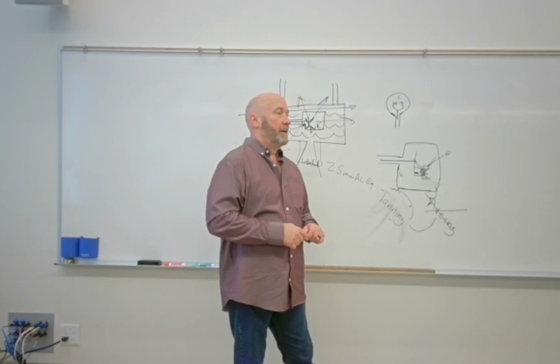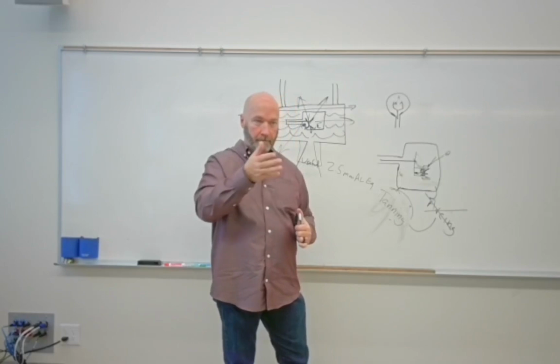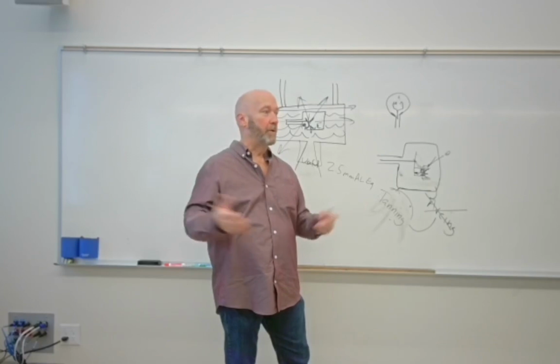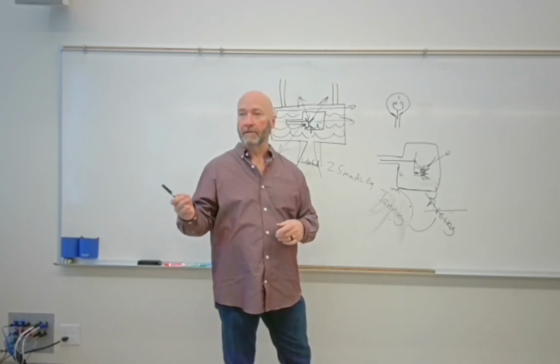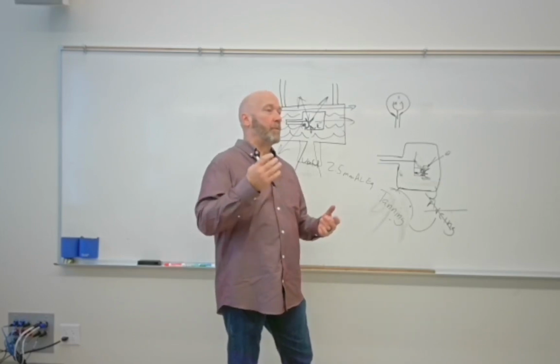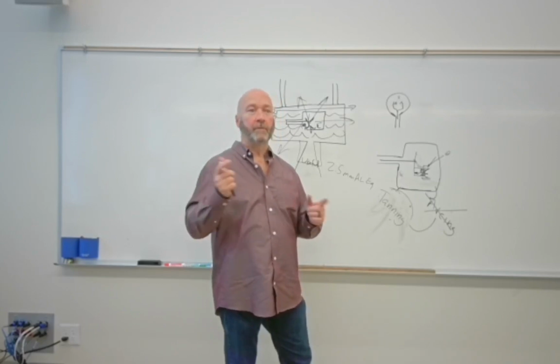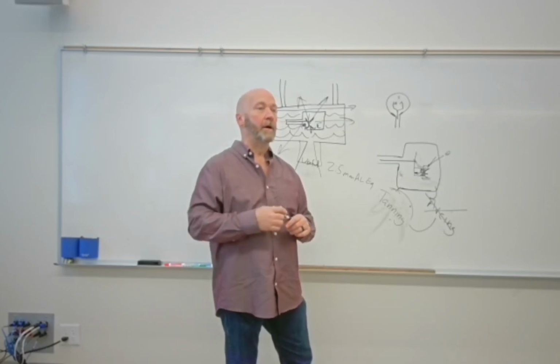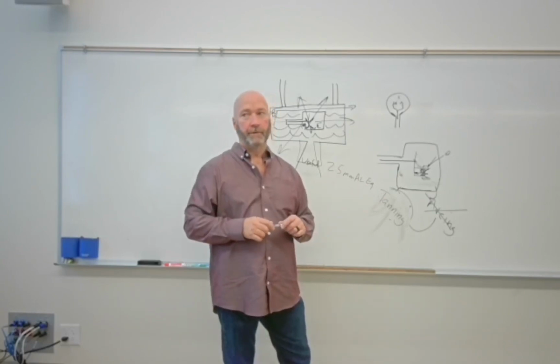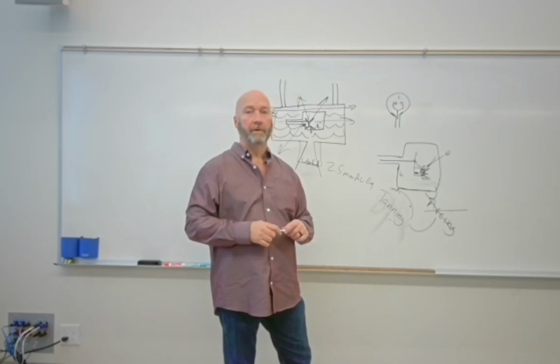Here's the thing: what is mAs? It's quantity times time. It's mA times time, right? So it's the overall mAs. It's just a count of electrons. That's all it is. So what's going to be the difference between a 100 mAs exposure on small filament and a 100 mAs exposure on large filament? Are you going to have a difference in image receptor exposure between those two? No. The answer is no. 100 mAs is 100 mAs, regardless of where it's coming from.